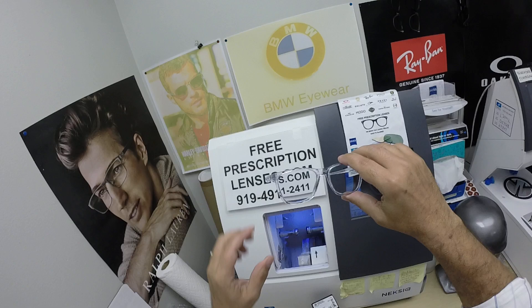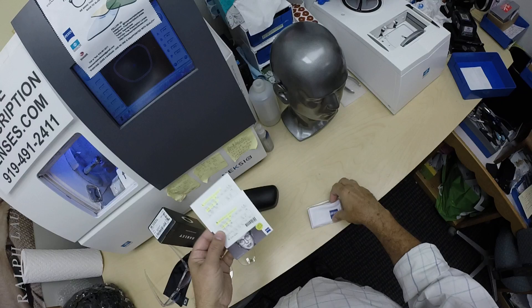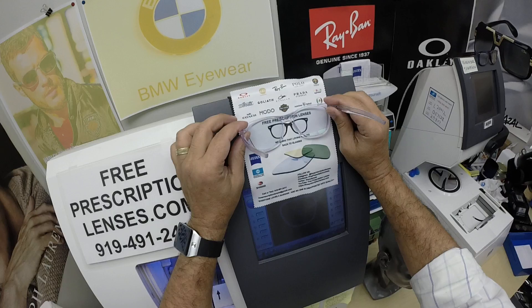Everyone pay attention, I'm gonna get serious now. I love a polished clear frame with Zeiss Photo Fusion Blue lenses with the DuraVision Chrome anti-glare. I've highlighted the prescription for the right eye, same for the left. He's also going to get the Zeiss cleaning cloth.